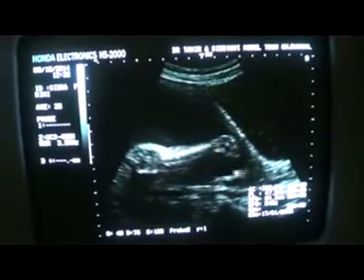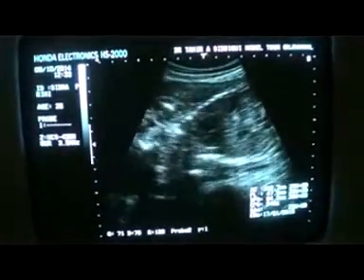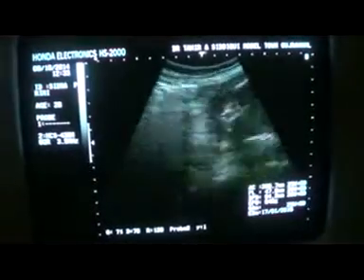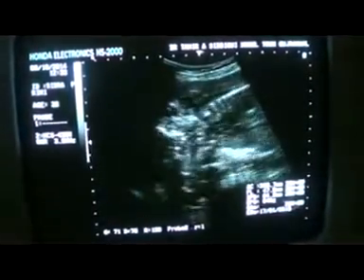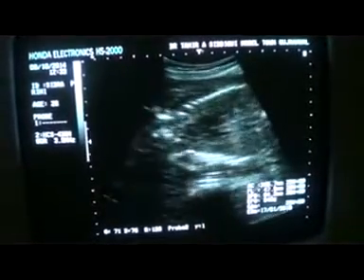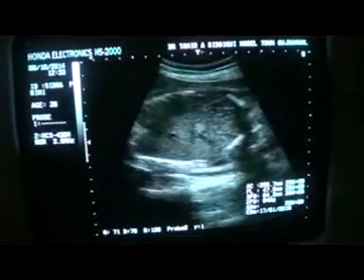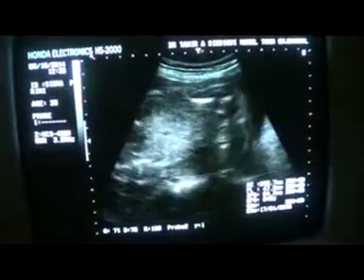This is the urinary bladder, and this is the dilated lower segment of the uterus, whereas in the upper anterior region we do not see this much amniotic fluid. This is the fetal heart, and the lungs, the liver. This is the liver now in front of you.